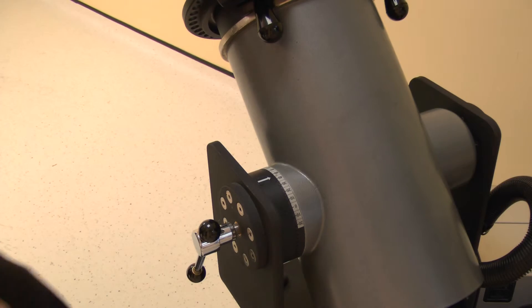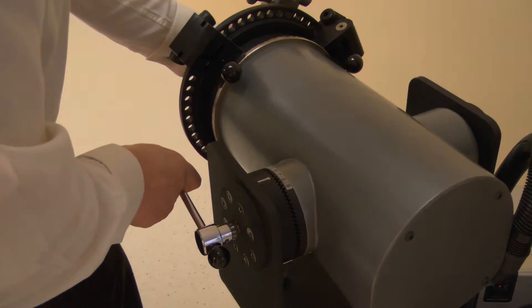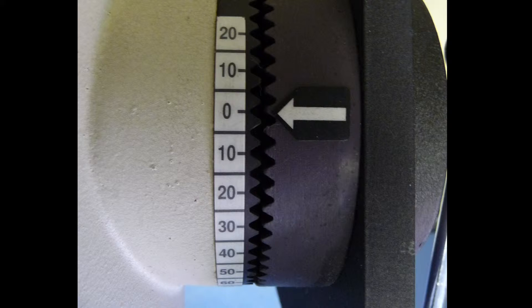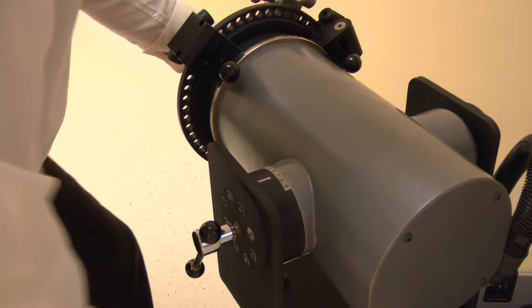Set the dynamometer tilt by releasing the locking handle and adjusting the tilt angle to 0 degrees. Lock by tightening the handle.